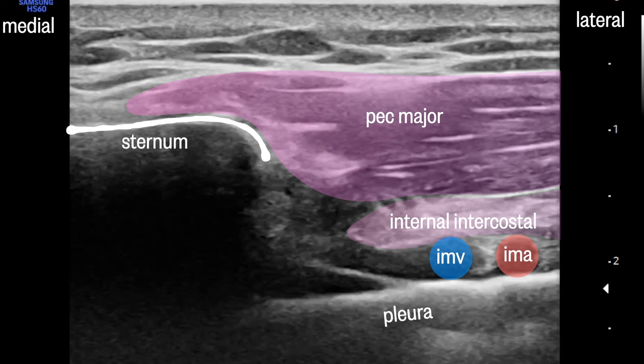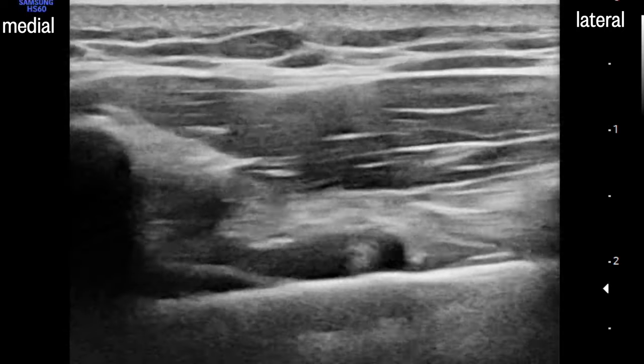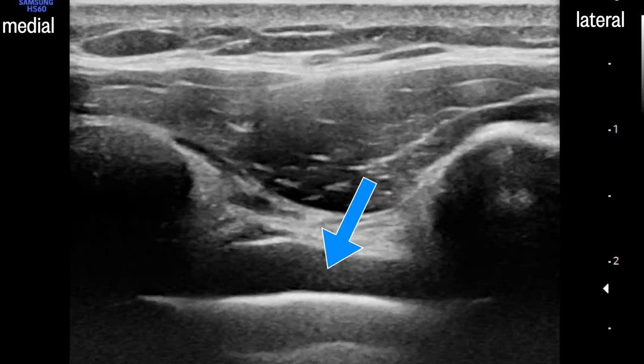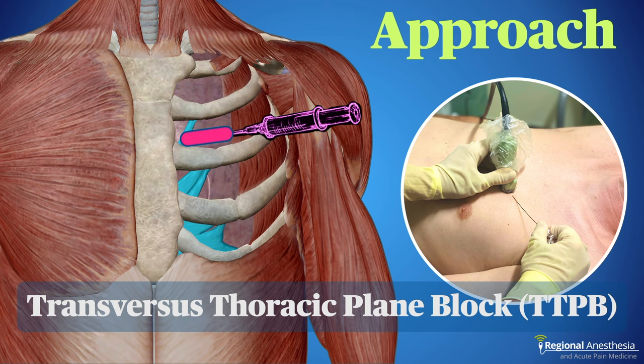Here's why it's important to clearly see the mammary vessels with the TTP approach. This is a transverse view showing the sternum and the muscles and pleura just lateral to the sternal edge. The internal mammary vessels are very clearly seen here in cross-section. If we rotate 90 degrees to the parasagittal orientation, we see a nice view of the cartilages and a dark area next to the pleura which almost looks like a nice target for intercostal block — but this is actually the internal mammary vein. Shifting the probe laterally brings up the pulsatile mammary artery. Anytime you're imaging vessels in long axis, it can be easy to miss them. Doing the TTP block in the parasagittal orientation requires very careful attention to these vessels, which could be not all that obvious.